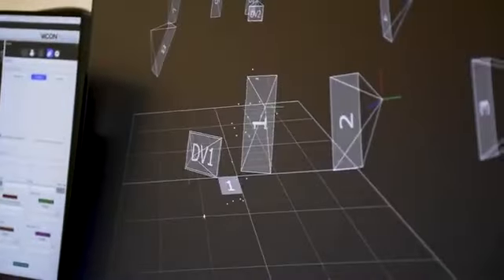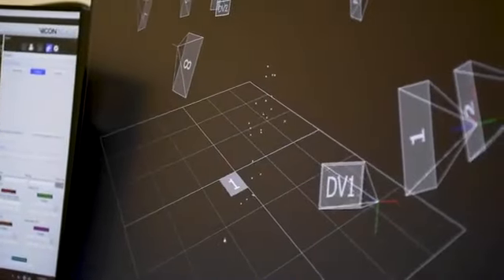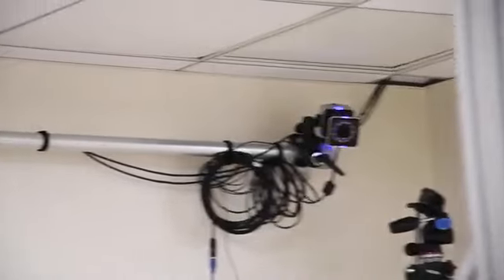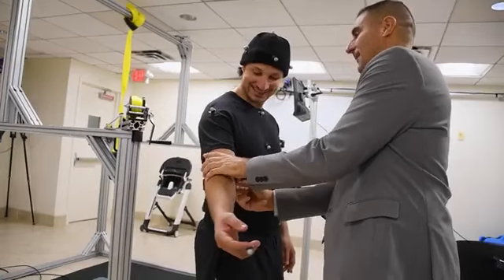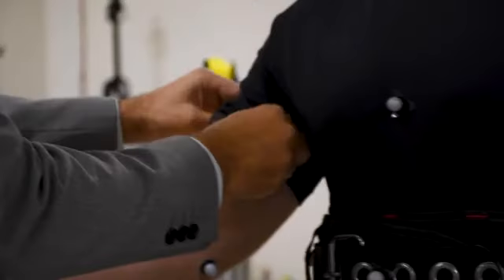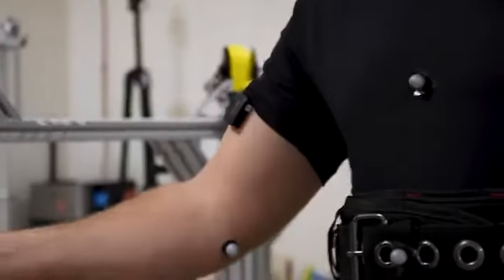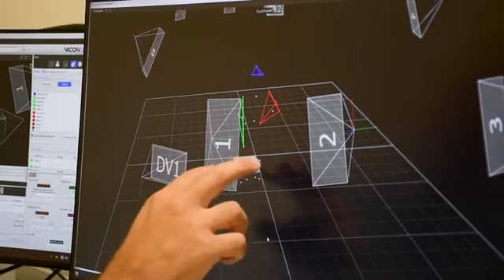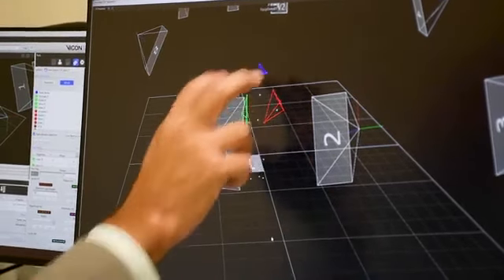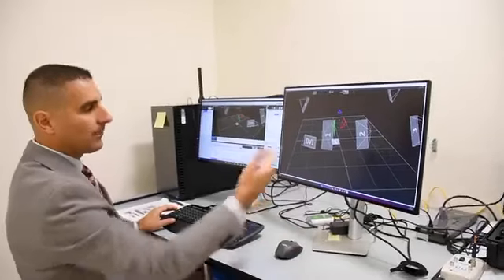One of the gold standard measurements in motion analysis lab is the use of infrared cameras. Flashing lights on cameras mounted to a metal beam in the lab face the rig. For example, we have a Vicon system of 8 cameras, and they detect the movement of reflecting markers. Waveforms on a computer screen. And then we stick those markers on anatomical landmarks that then later we can use in the software to recreate a link model. And from there, we can compute and analyze the data.